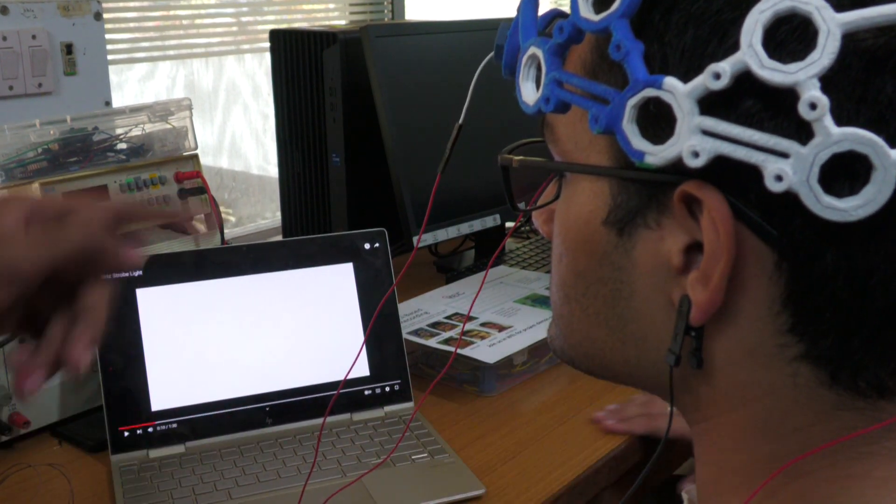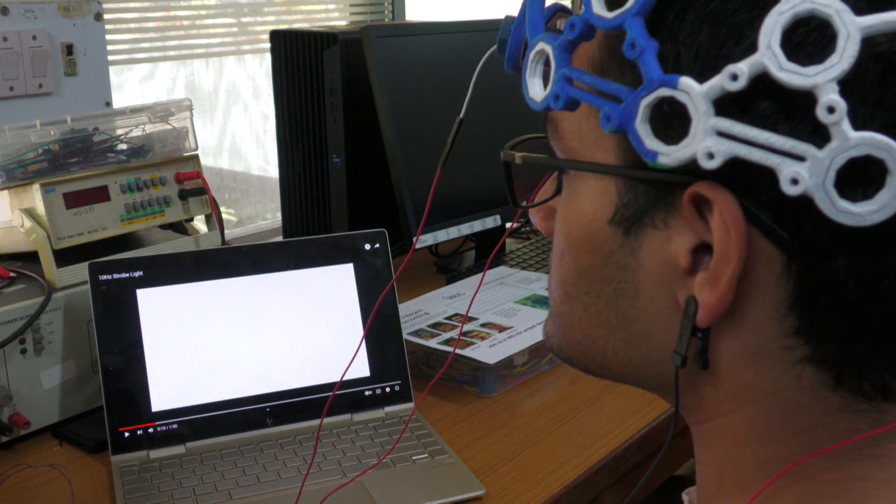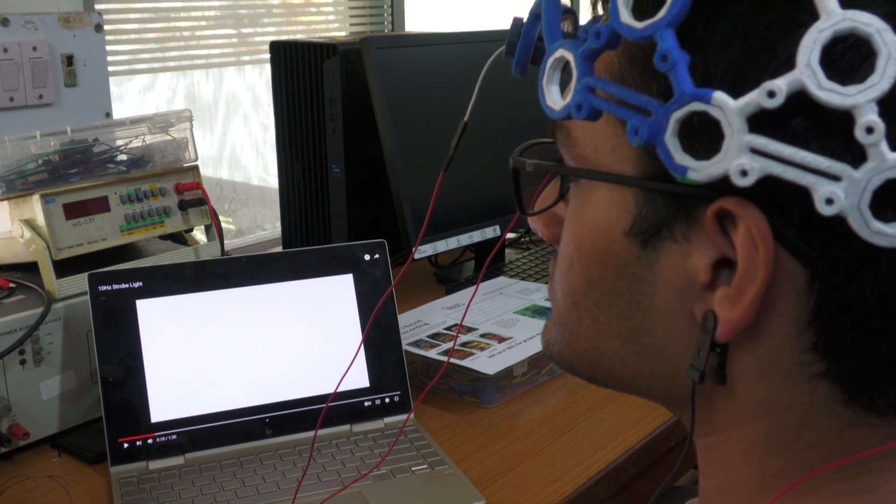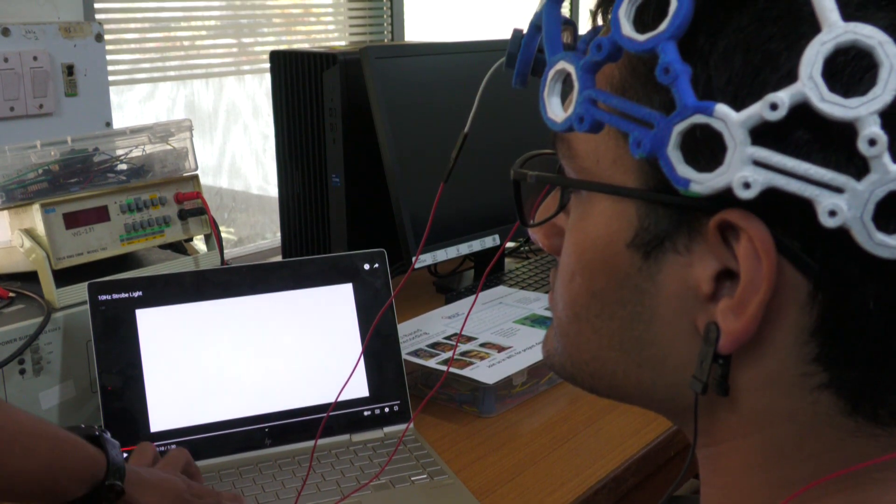So the subject will first blink a few times and then we shall expose him to the strobe lights.